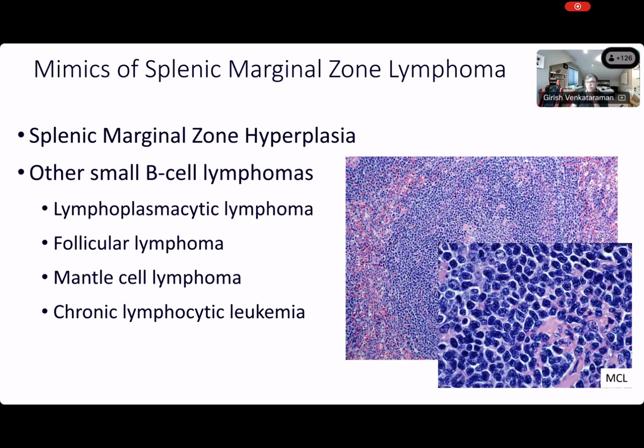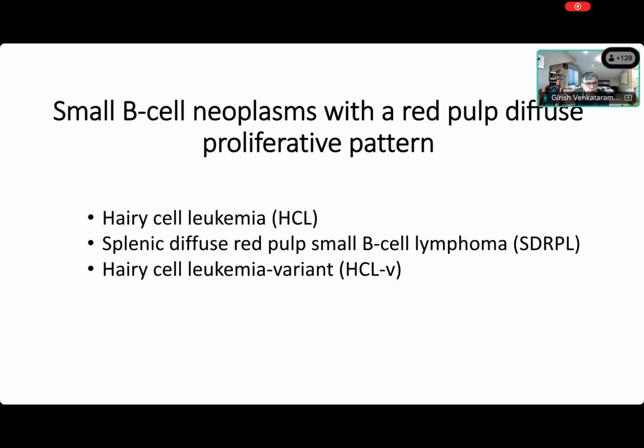This turned out to be mantle cell lymphoma, and obviously, mantle cells look centrocytic. They look exactly like follicular lymphoma sometimes. You cannot make the distinction just looking at the H&E. So use stains if you have to. And obviously, that patient had known lymphoma there, so it was not a huge diagnostic confusion trying to get to mantle cell lymphoma.